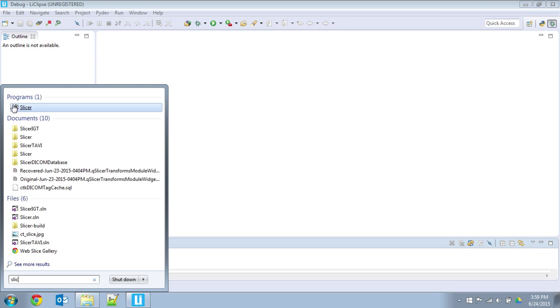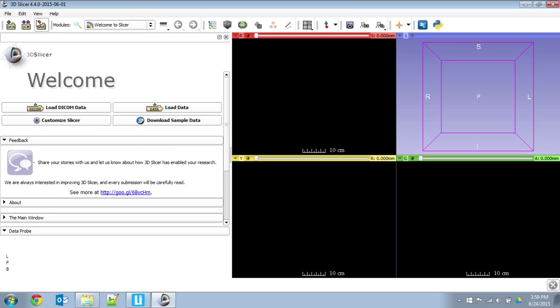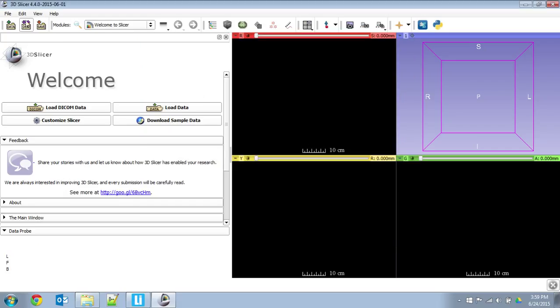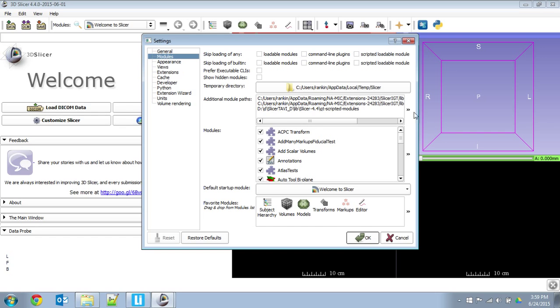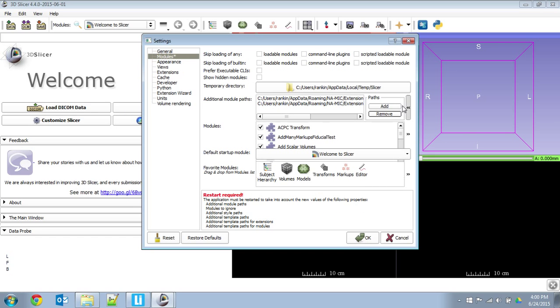So I'm going to start with Slicer. And I believe in this install I already have Slicer IGT installed, so you'll see some settings related to that. Oh, sorry, that was a little bit too quick. So under Edit, Application Settings, under Modules, oh, it's already there. Well, let me remove it, so this is as if Slicer IGT is already installed. You can see its location there, which is great.